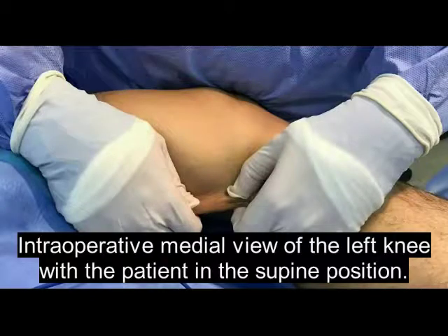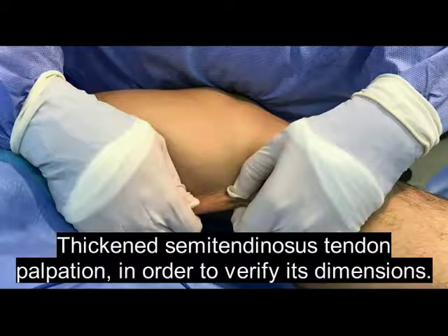Intraoperative medial view of the left knee with the patient in the supine position. Thickened semitendinosus tendon palpation in order to verify its dimensions.